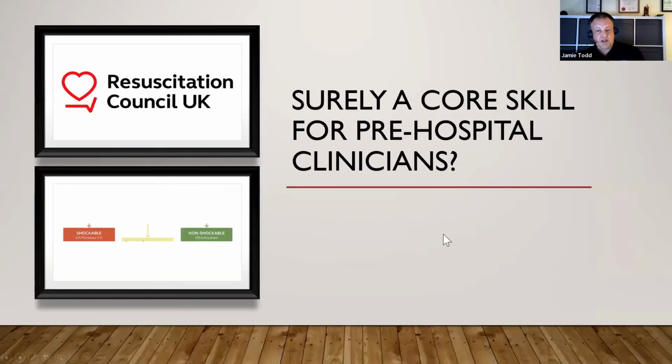So surely this should be a core skill for pre-hospital clinicians. Certainly at ALS level, it has been historically, isn't it? But even at ILS level, ambulance technician, AAP level, and definitely at paramedic level, historically they've all been taught manual recognition of cardiac arrest rhythms by visual representation from the monitor screen, and then making an appropriate decision based on their knowledge or the knowledge of the team if there's more than one provider there trained in that skill.